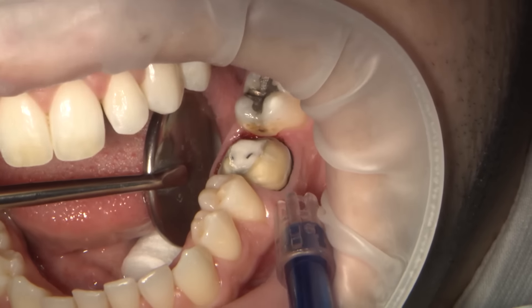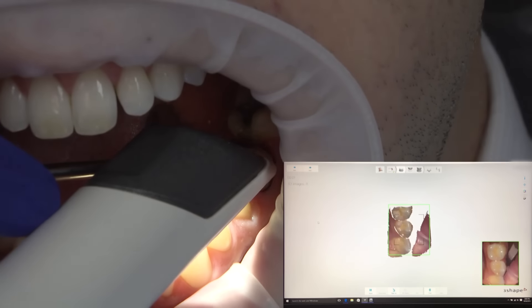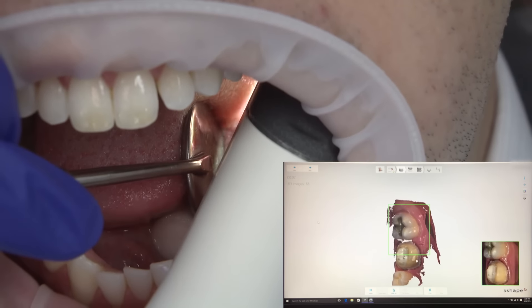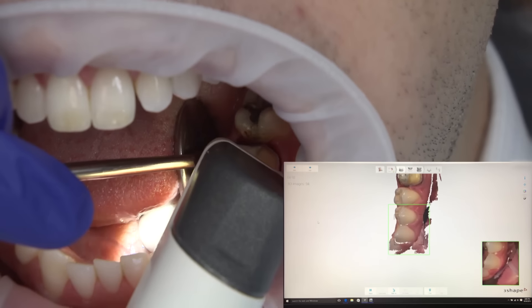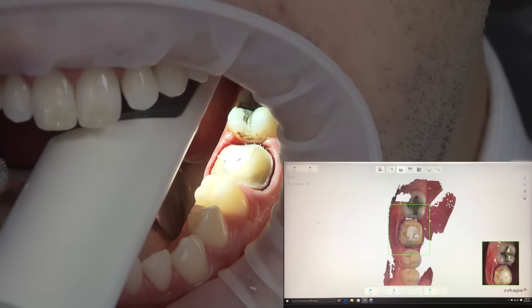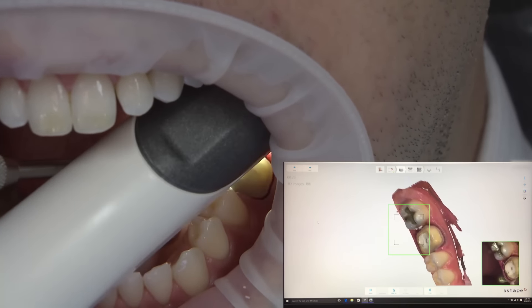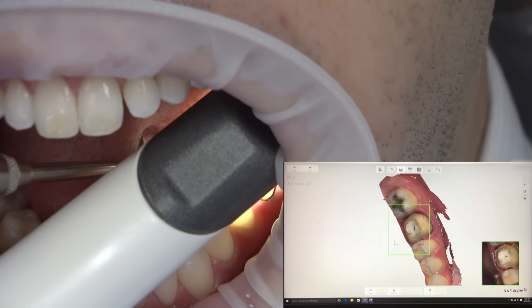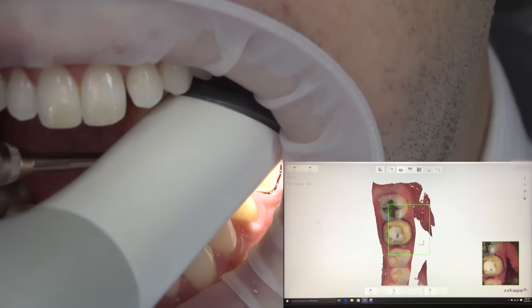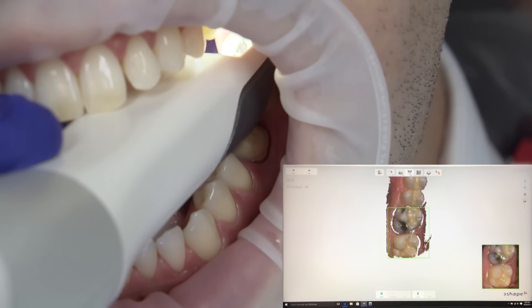For the impression, we will capture the site digitally with the three-shaped Trios 3 scanner. Here you can see how quickly the system acquires the preparation field. Once I'm positioned over the teeth, I press the button located on the handle of the camera to begin operation. I start with the occlusal scans to lay the foundation for our digital model. Once I reach the distal neighbor number 18, I begin rotating the camera to the buccal, move toward the mesial, and then roll over the occlusal to the lingual and finish with this area. Because the system scans very accurately in color, it's easy to determine what areas are missing, as there are distinct holes on the model generating on the screen.